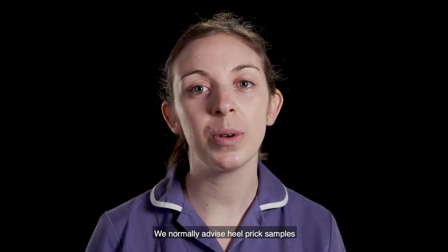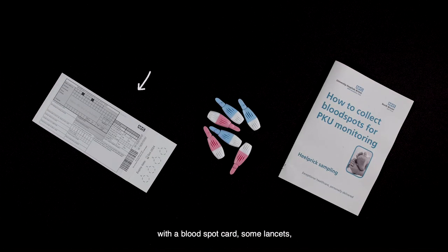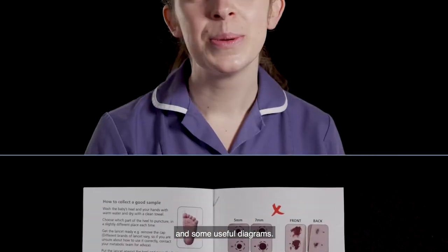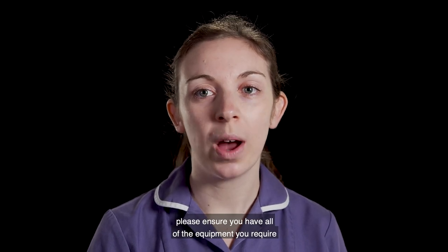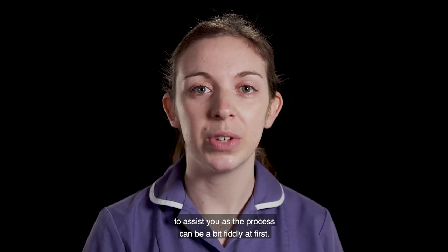We normally advise heel prick samples for children less than one year of age. The Metabolic Nurses have provided you with a blood spot card, some lancets and an information leaflet to explain the process, which contains a picture of an example card and some useful diagrams. Before completing the blood spot, please ensure you have all of the equipment you require ready with you. You may find you also need a friend or relative to assist you as the process can be a bit fiddly at first.